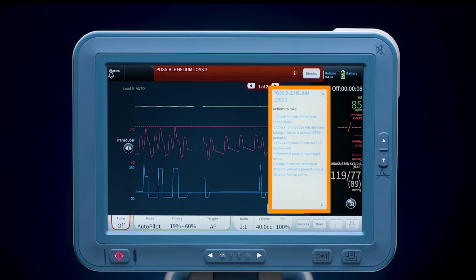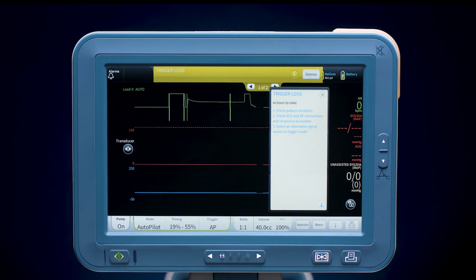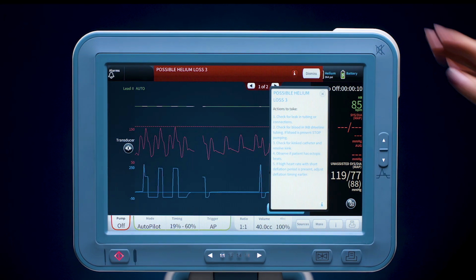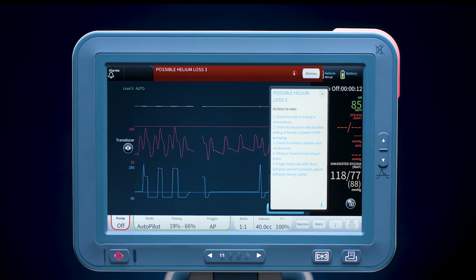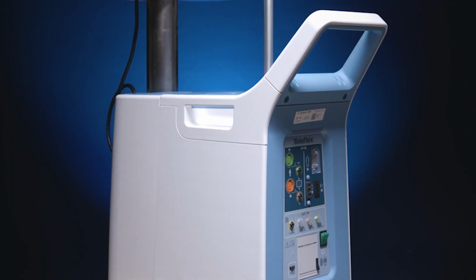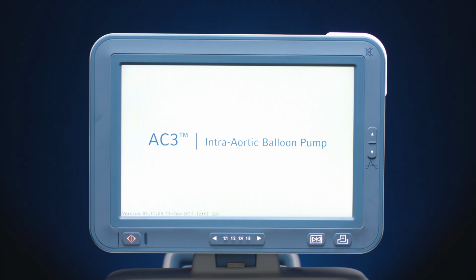Corrective actions information will automatically be displayed for high priority alarms. This information will remain displayed for up to 2 minutes to allow the user to have immediate access to troubleshooting. For other alarms, press the eye icon to access actions to take. All messages and related information will be available on the display even when the audio tone is silenced. Once the corrective actions are completed, the user can resume pumping by pressing the On key. A user-friendly design, intuitive interface, and state-of-the-art autopilot mode makes the AC3 Optimus IABP simple to use.